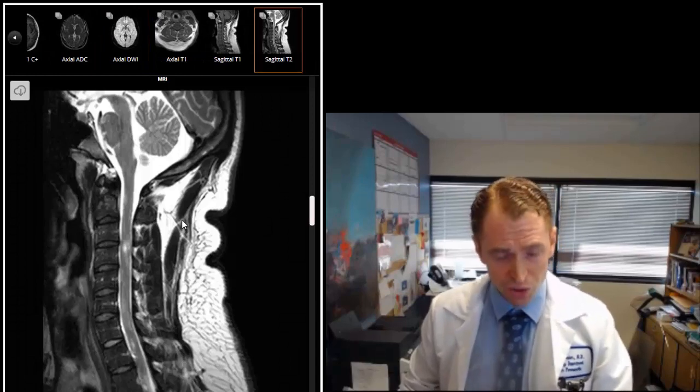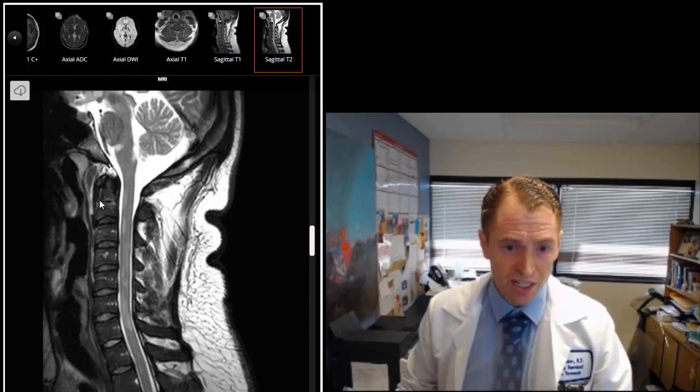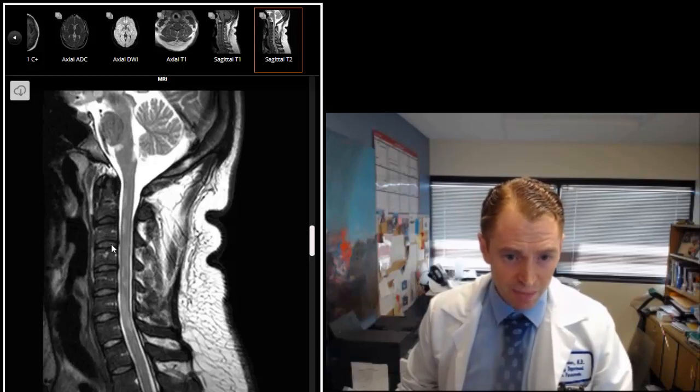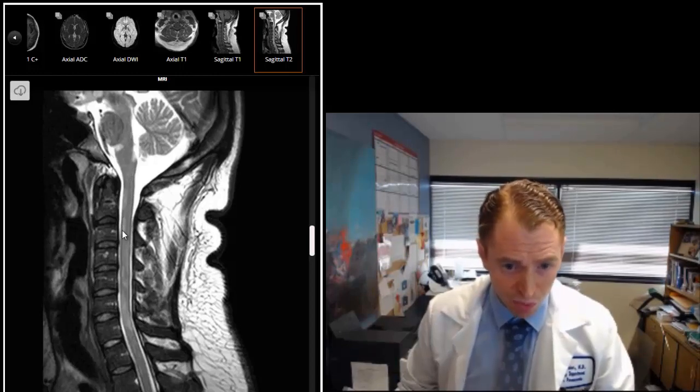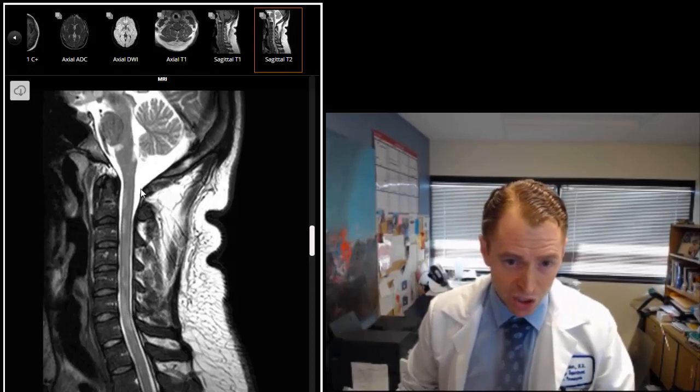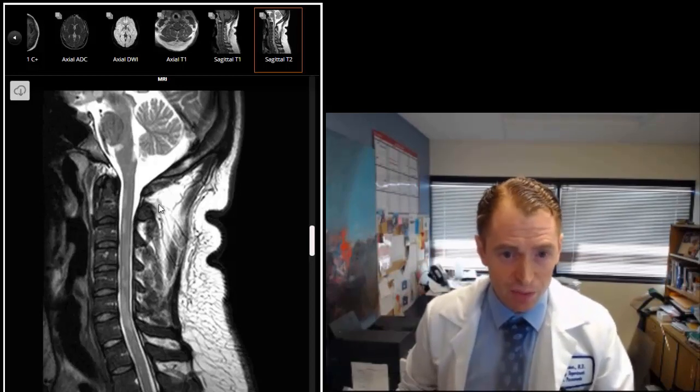This is a T2 sagittal image of the cervical spine. You can see the bones, the vertebrae. This is C2 and C1. These are the discs in between the vertebrae. The spinal cord is normally dark on T2, but you can see these bright areas which are the multiple sclerosis lesions. There's this normal brightness of cerebrospinal fluid. The type of fluid we're extracting during the spinal tap around the spinal cord.